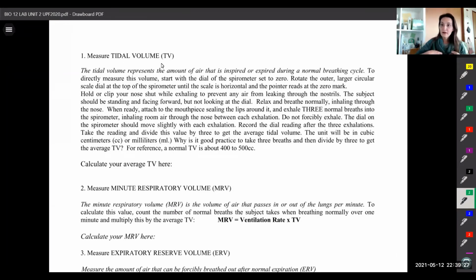And so what I'm going to do here is I'm going to use the measurements that I took using the spirometer in the lab room. So these are actually my own measurements. They're not great measurements, but they're measurements nonetheless. And I'll just remind you at each step along the way what value you would be using potentially, given that you're going to use the numbers that are there on the lab tutorial. And of course, there's going to be some deviation here, like I said, in terms of what values you get in the end for your volumes, given that you are different sexes, ages, heights, what have you. So those values will differ.